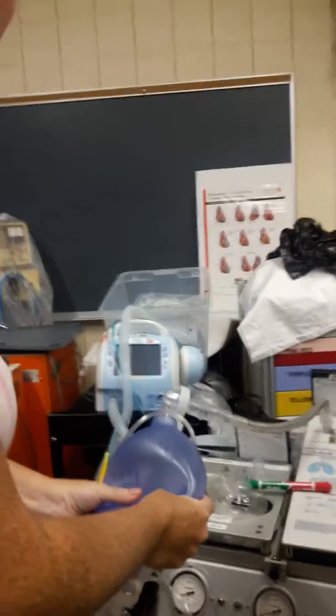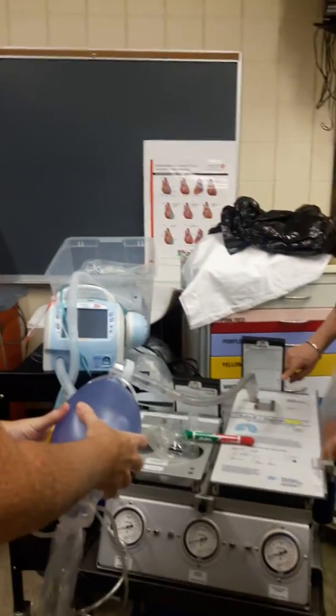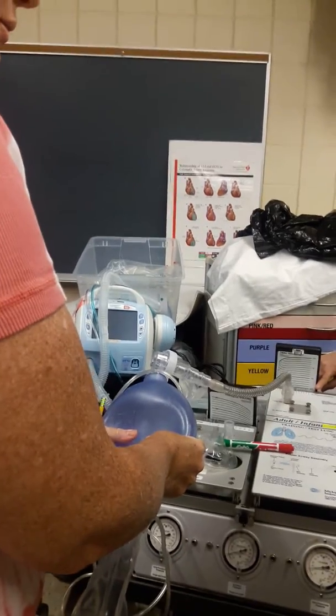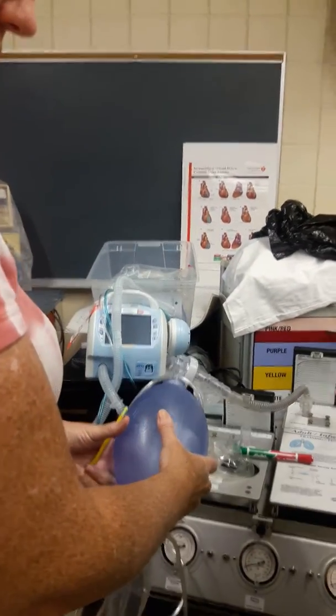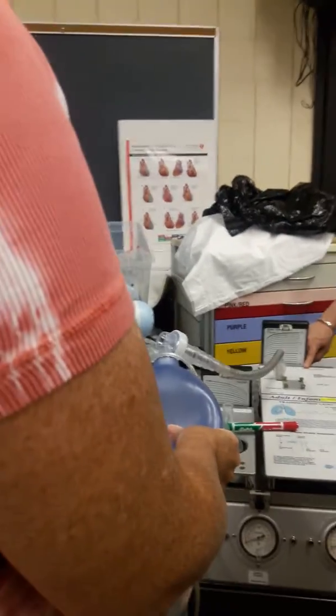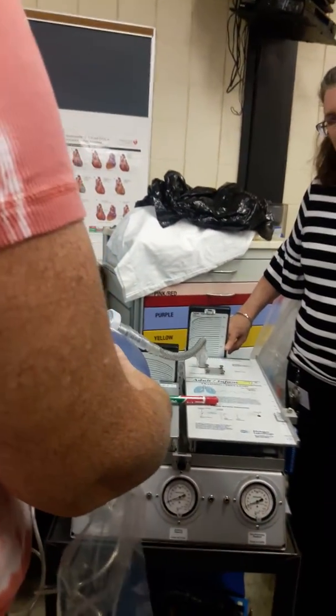How come it says -10? It's not -10, that's just a line to line up. So that's normal compliance, and your pressure when you do the inspiratory hold is about 5. Everybody good?